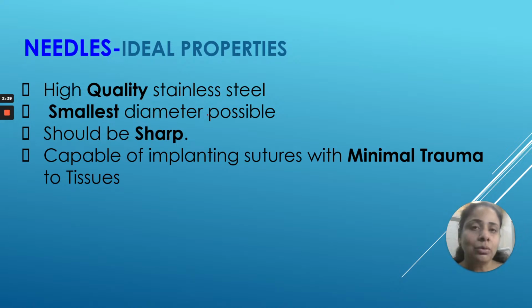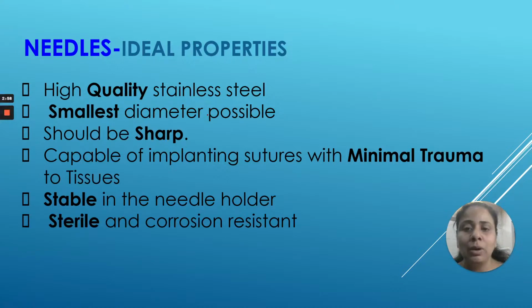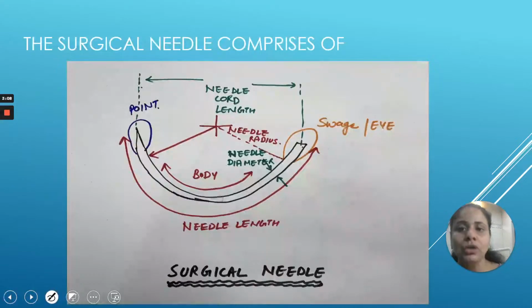And it should give minimal trauma to the tissues, because if you are using a very big needle in, suppose, the oral cavity, it is going to give a big needle hole, and the bigger the hole is, the more the healing time. And it should be well stable in the needle holder, and it should be sterile and corrosion resistant. So if you see any signs of corrosion on the needle, please discard it immediately. That is the needle which is not to be used.